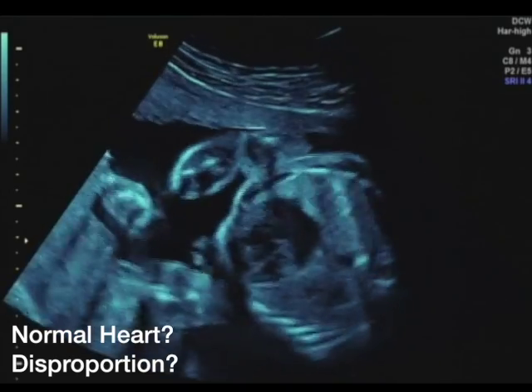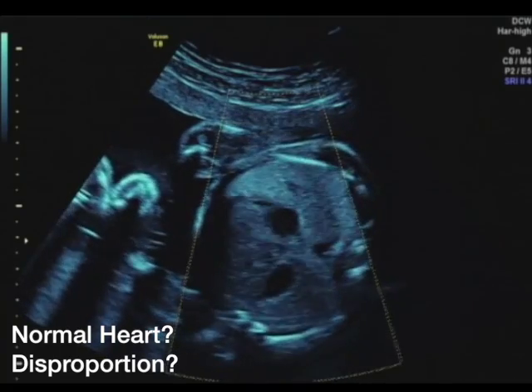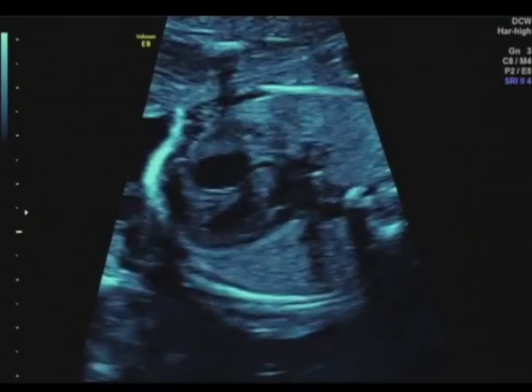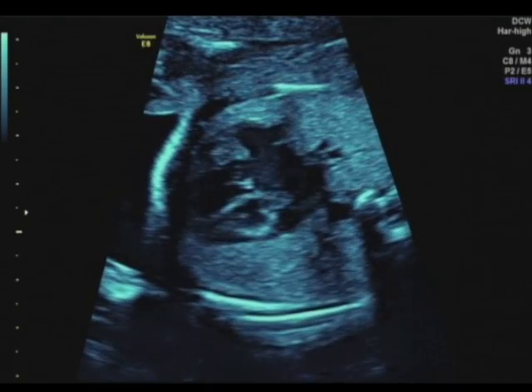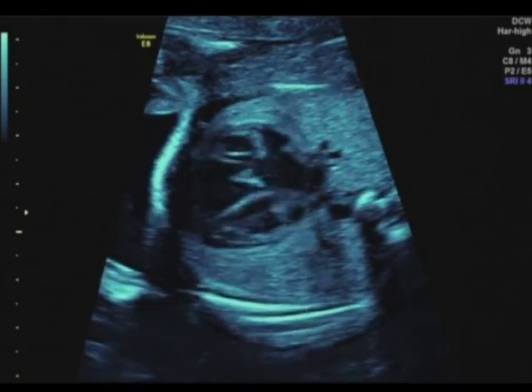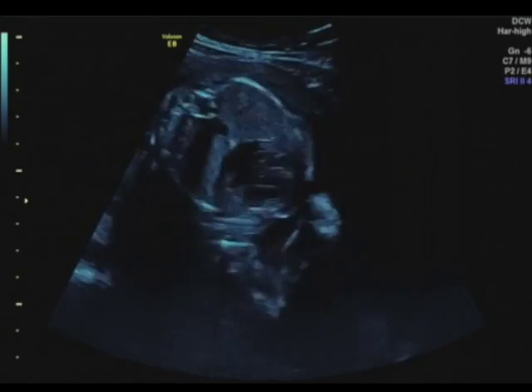Sonographers observe the fetal heart for variations or abnormalities of position, size, function, rhythm, and chamber size or vessel size proportion. This case was referred for disproportion at 21 weeks on the routine growth scan. Here you can see that the right ventricle is quite larger than the left ventricle.